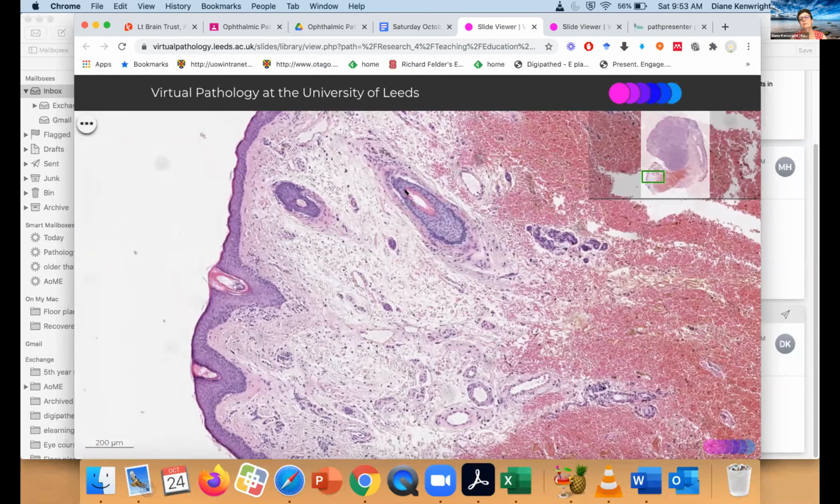We've got conjunctiva. So if we look carefully here, we've got some little goblet cells. Once it's rendered, it's just moving slowly across. Some little goblet cells, plasma cells because it's inflamed, some blood vessels, but we have got no skin adnexa. As we come up here, we've got lots and lots of sebaceous glands, which are probably glands of Zeis.